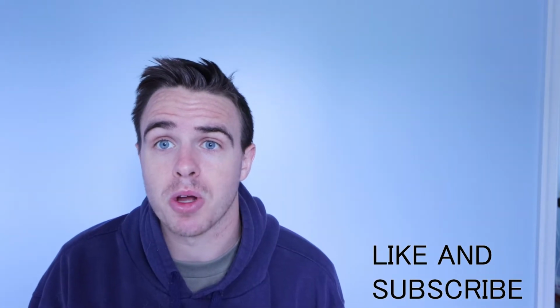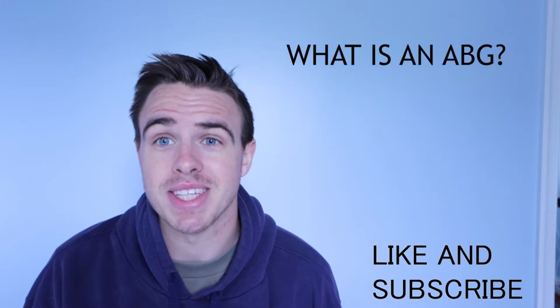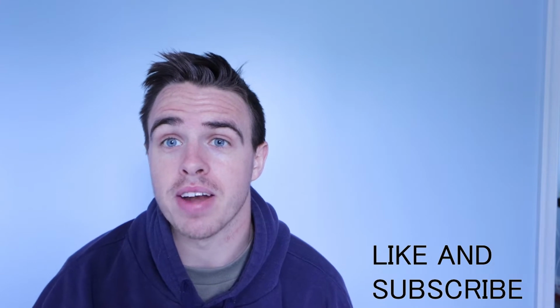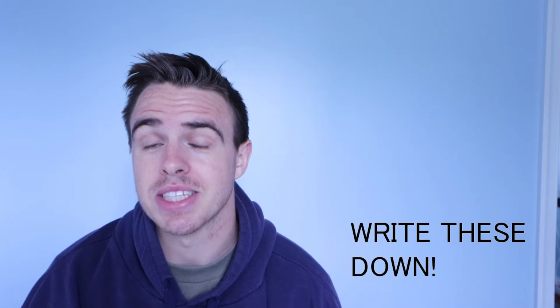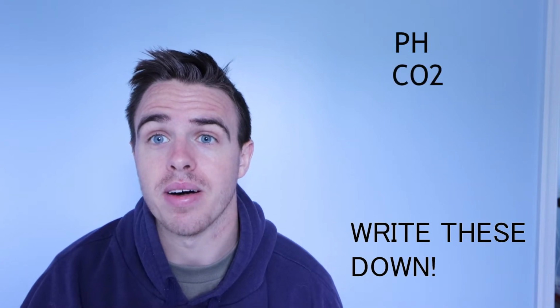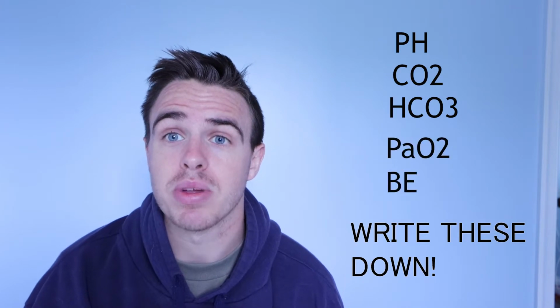So in today's video, I'm going to be talking about ABGs, also known as arterial blood gases. So what is an ABG? An ABG is when we draw arterial blood and then we run it through some kind of machine, and it lets us look at the blood chemistry. The blood chemistry that we can look at from an arterial blood gas would be the pH of the blood. We can look at the CO2 level within the blood, the bicarb level, the pressure of oxygen within the blood, as well as the base excess.